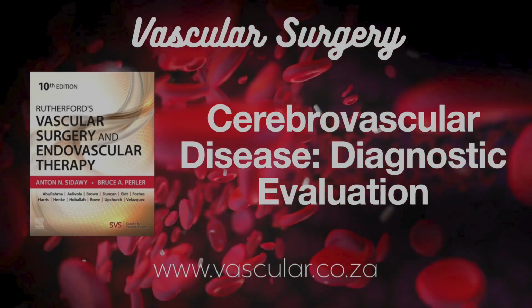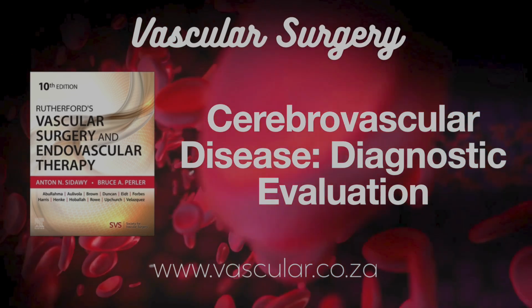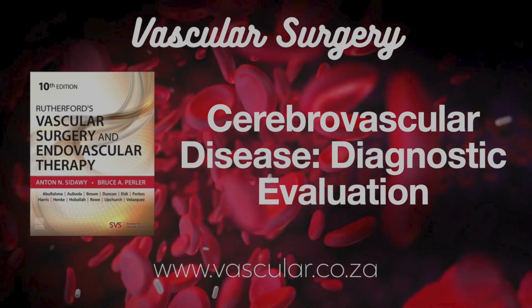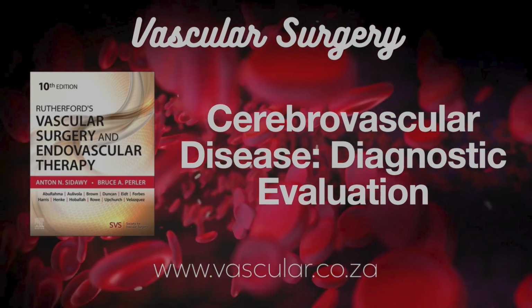Yeah. Why isn't TOF MRA used all the time then, given the gadolinium issue with CE-MRA? Well, MRA in general, both types, just isn't as widely available as CT or ultrasound.